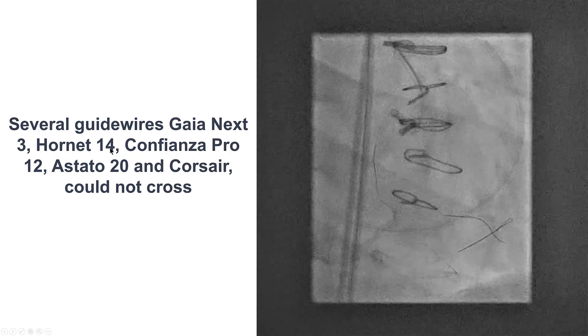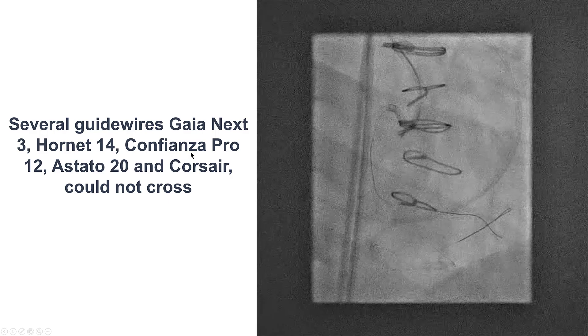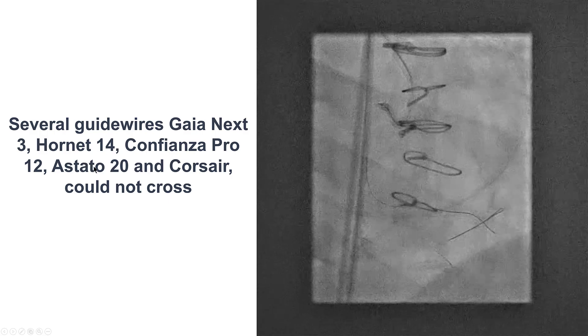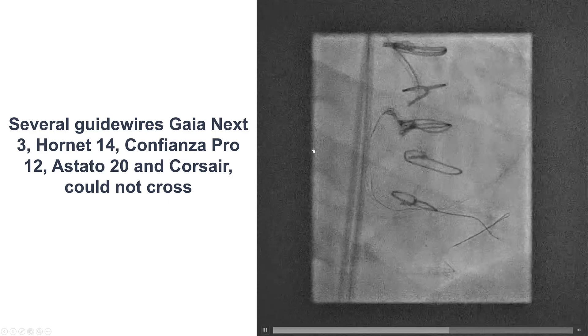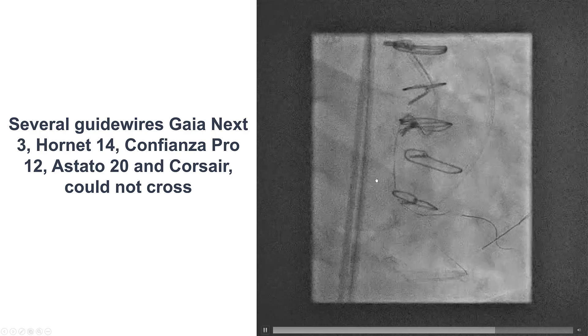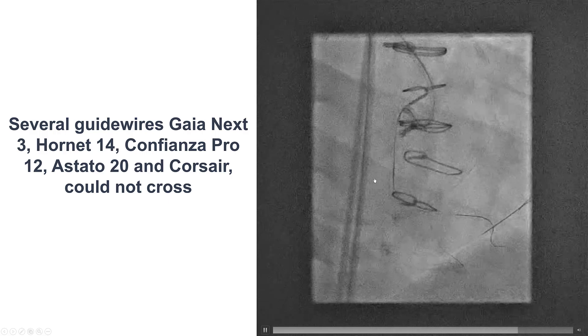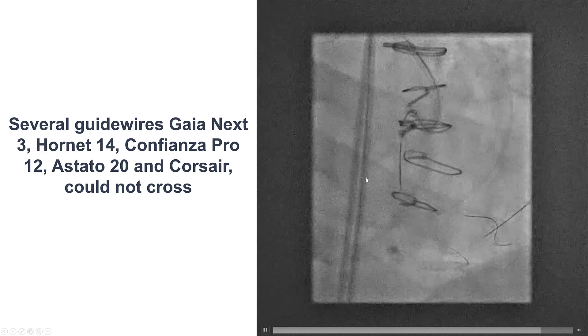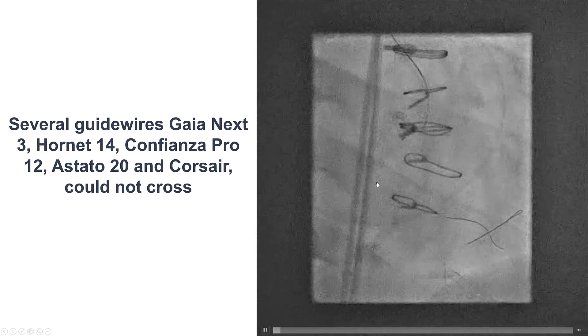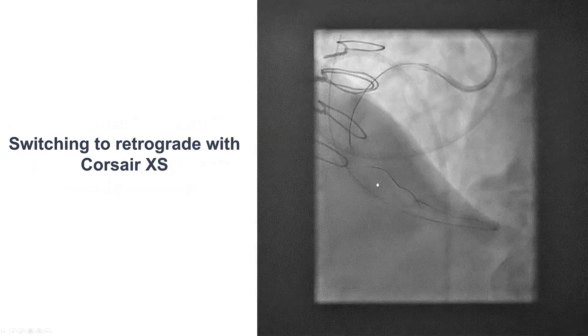We then used the Gaia NEX3, a Hornet 14, Confianza Pro 12, a Stato 20, and exchanged for a Corsair microcatheter. But once again, we were unable to cross through the proximal cap.